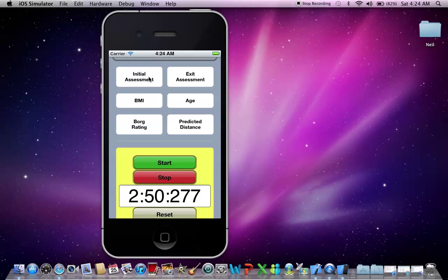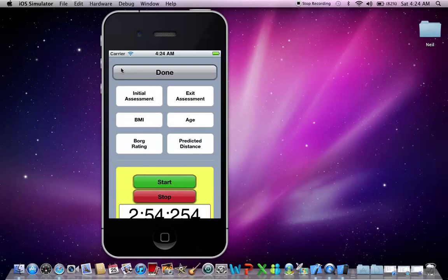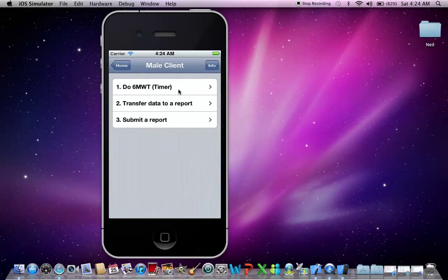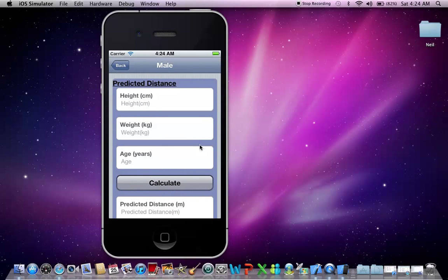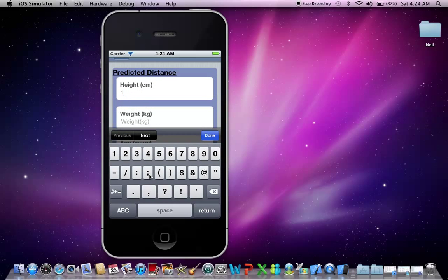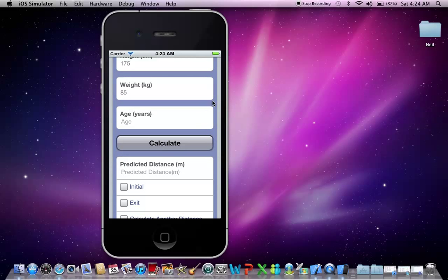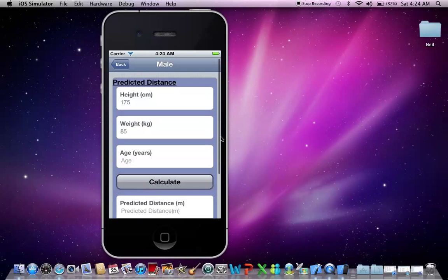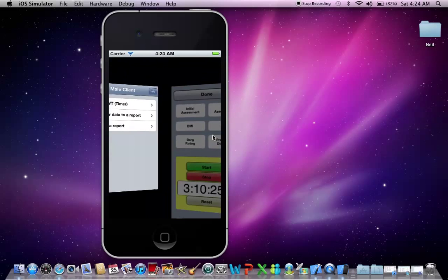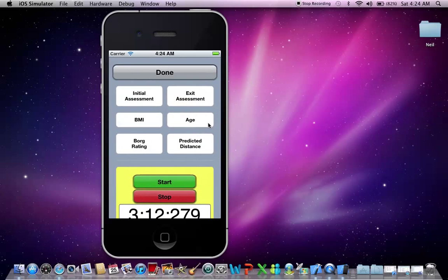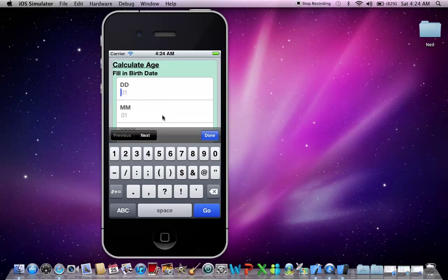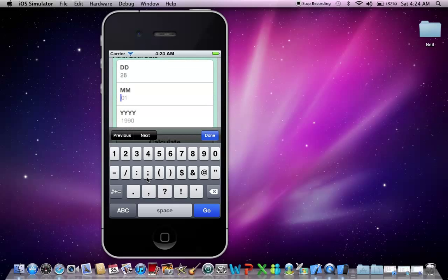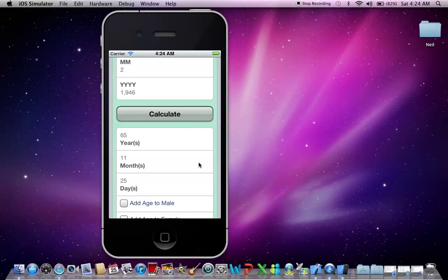So let's go to the initial assessment, don't have anything there, so let's fill that in. Let's start with a predicted distance for the client. So for example, let's say our client is 175 cm, the weight is 85, and the age, well, let's say I don't know what his age is, I can actually put in his date of birth here. Let's say the 28th of February 1946. Let's calculate his age there.